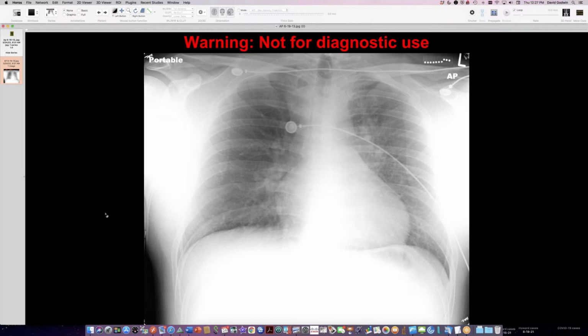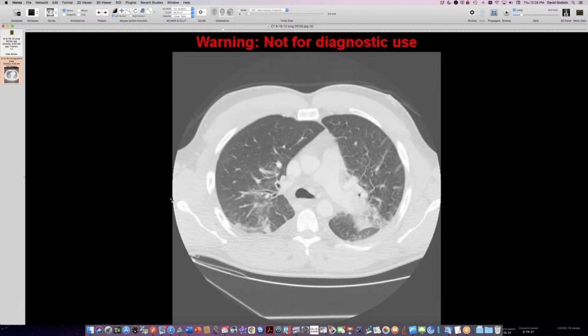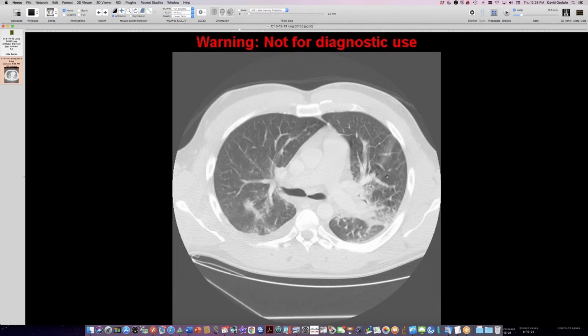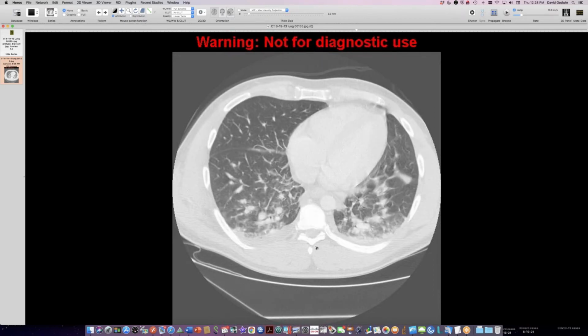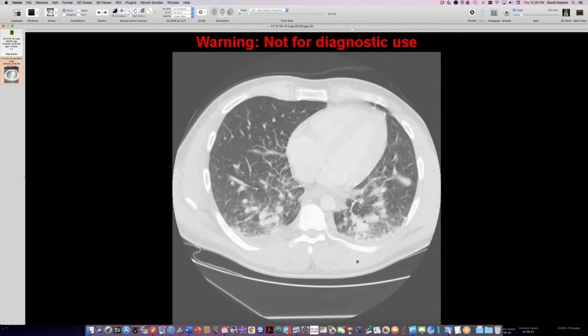And hope I can advance. And I have a few images here from CT. You can see that there is indeed consolidation here in the left upper lobe, and there's quite a bit of edema here in the lung. Just like that, there's edema on the other side too, with nice septal lines. And then basal stuff, I kind of wonder if maybe it's dependent edema or some aspiration or something. There are pleural effusions.